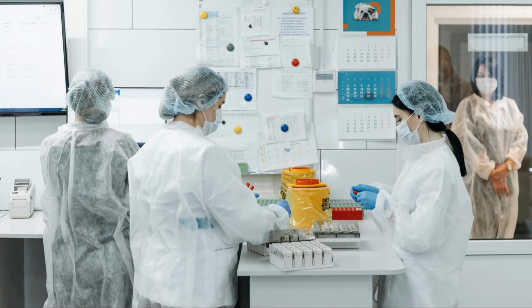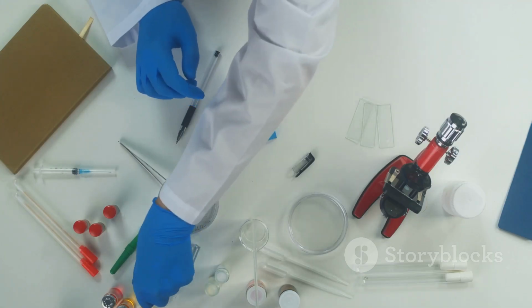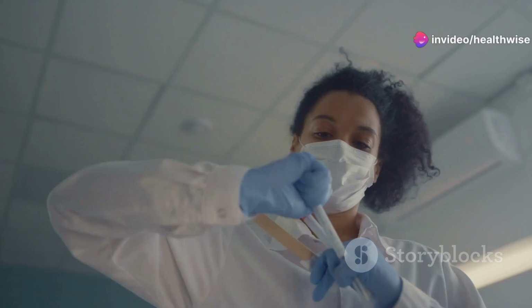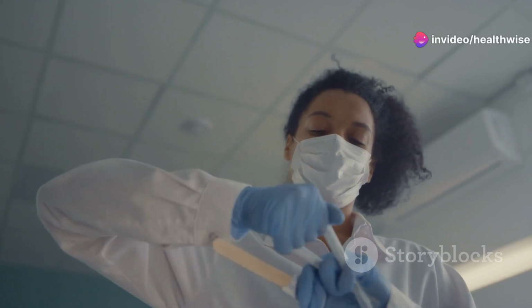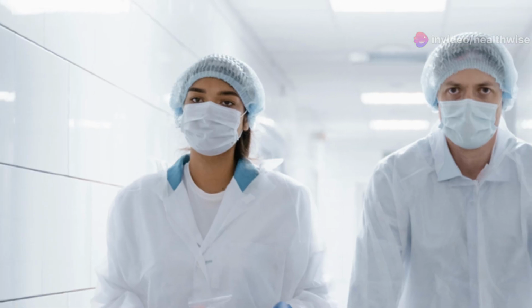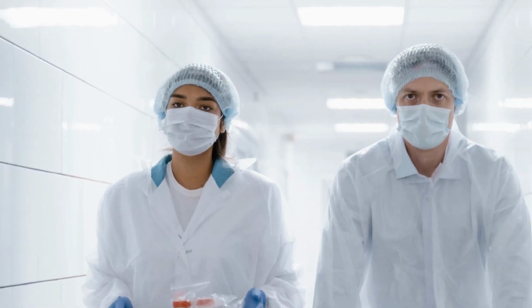It's crucial that each specimen is labeled correctly with the patient's details, type of test, and the date and time of collection. Accurate labeling prevents mix-ups and ensures the right tests are conducted on the right specimens. Finally, dispatching the specimen to the respective department.